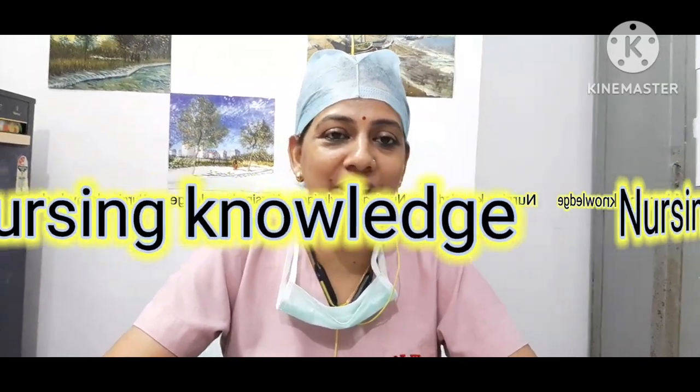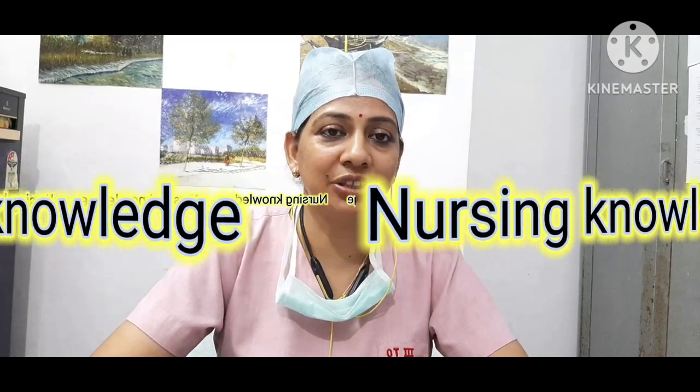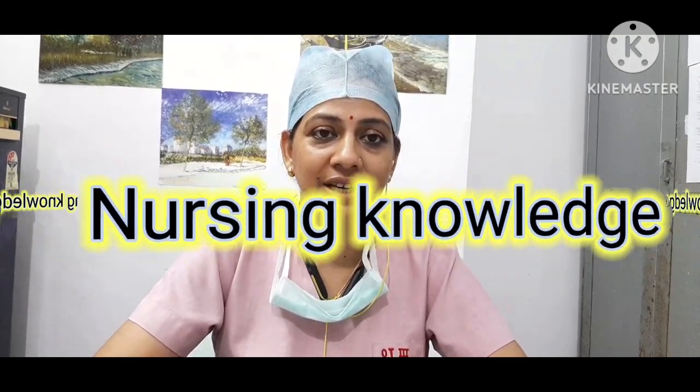Welcome to the Nursing Knowledge. I am Hindu Yado and today I am going to tell you how to prepare a fistula trolley, how to prepare instruments, and their names and uses. So let's start.